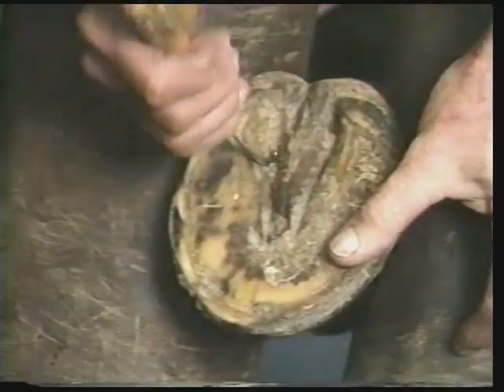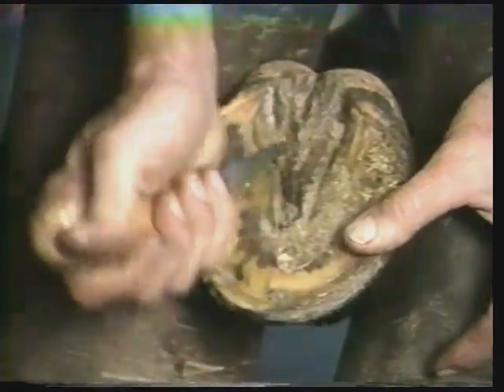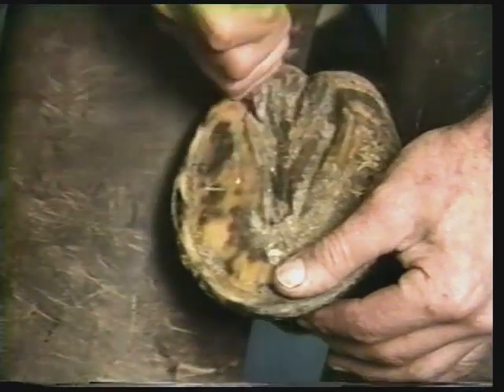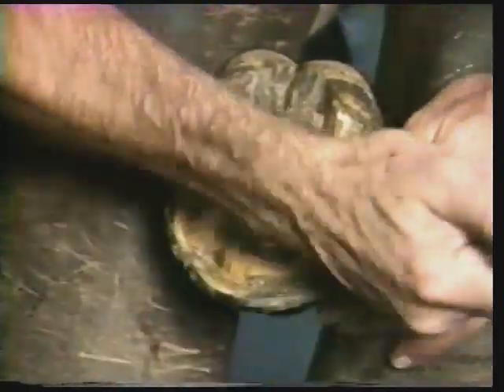Let's consider all factors normal and consistent with machine, film and screen, and developing process. Now let's go to the foot. I wish to prepare the foot so that I have no debris on the underside of the foot, on the outer side of the foot, on the bulbs of the heel, or on the hair immediately above the foot.